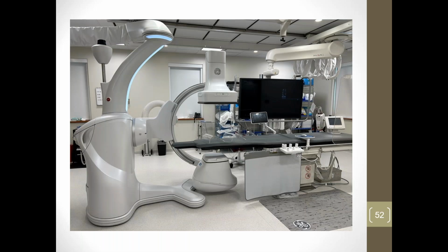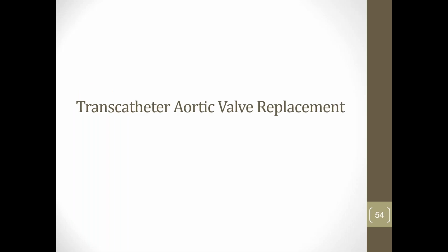So again, hard to see this, but this is a robotic cath lab in the OR. So this special table, and you've got your traditional C-arm. This one will actually spin 360 degrees, so you can do like a one-slice CT scan with this. It takes forever to process the images, but it will do it. And then this right here is your surgical robot. One of the procedures that they'll often do in the hybrid OR is called a TAVR, which is a transcatheter aortic valve replacement.